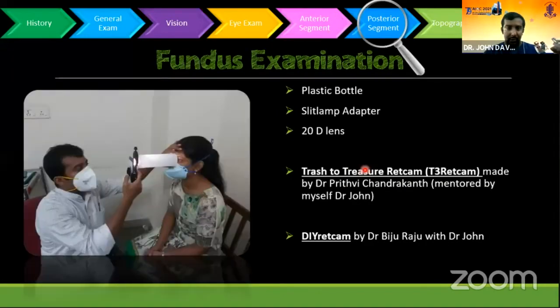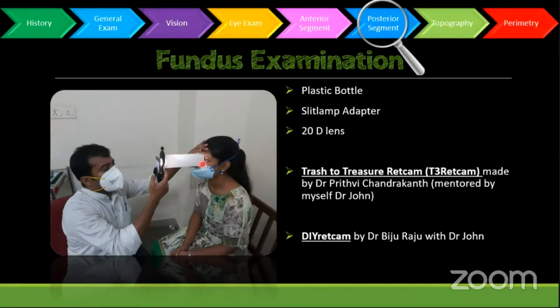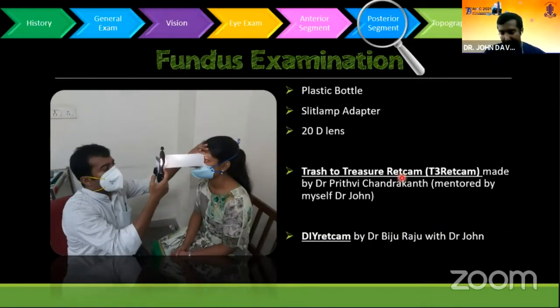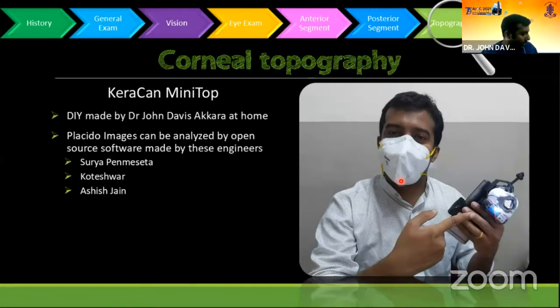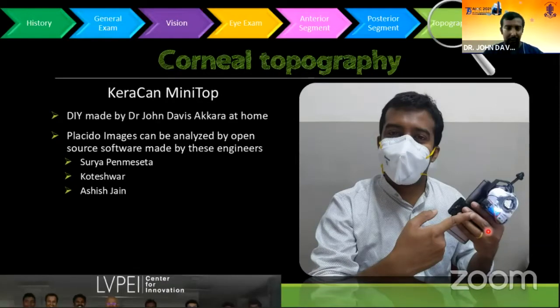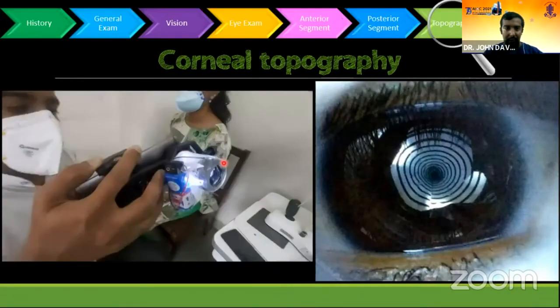This is the universal smartphone adapter and a plastic bottle — actually a hand sanitizer bottle — which we can use to make a fundus camera. This is by Dr. Prithvi Chandrakhan. And this is one innovation by myself: the Kerakan mini topographer. It has a Placido cylinder inside with LED illumination all around. You can take topography pictures using that, and this is how I aligned it to the phone to take photographs.